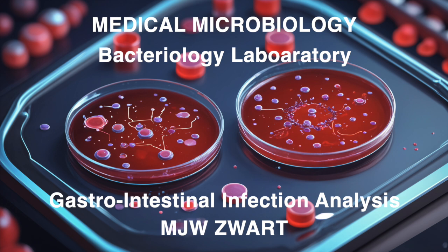But Gemini found something interesting about this, didn't it? It did. Apparently, some Salmonella strains, well, they need a bit of encouragement. They need to be boiled to show their agglutination properties. Who knew bacteria could be so shy? It makes you wonder what other secrets they're hiding.